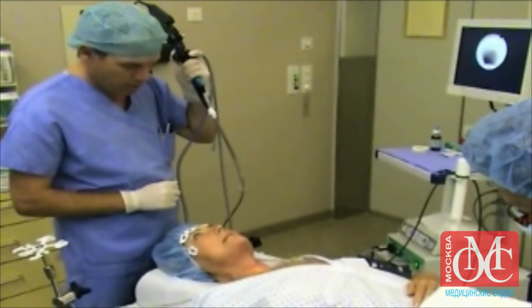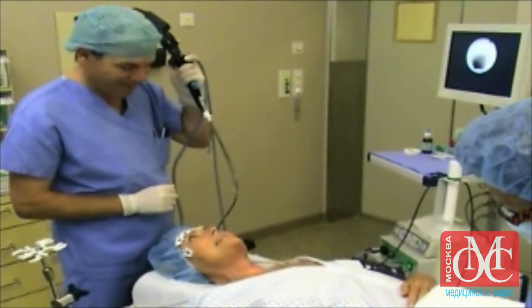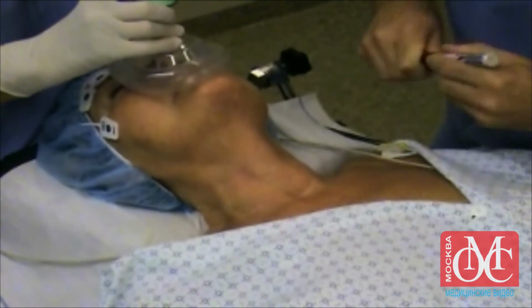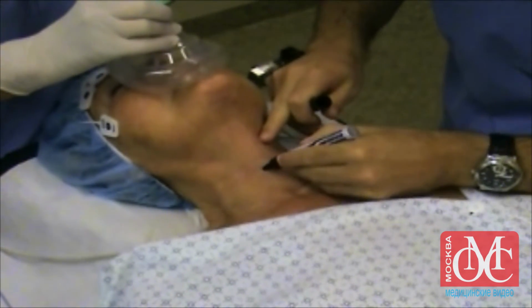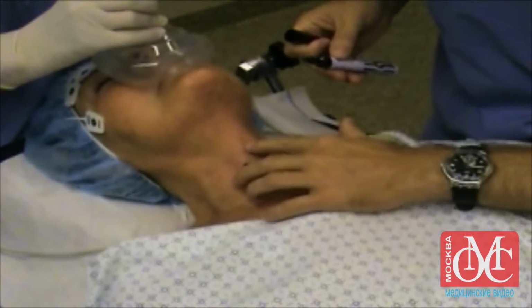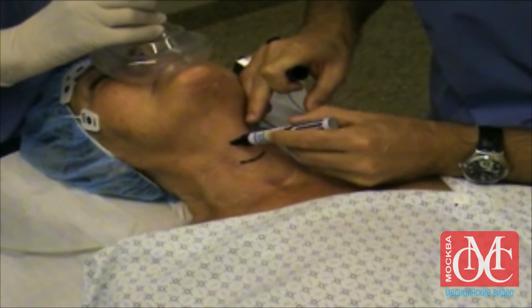The introduction of local anesthetic within the trachea and the supralaryngeal region will improve patient comfort and render the procedure easier. Alternatively, you can introduce the anesthesia by direct injection via puncture of the cricothyroid membrane. This direct injection technique is reliable, time-efficient, and easy to perform.